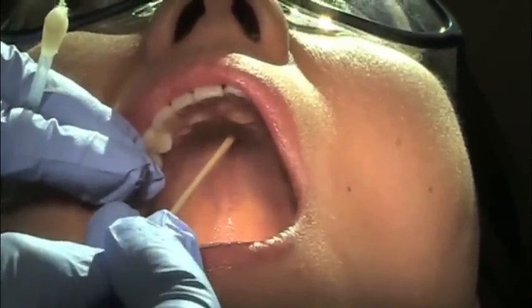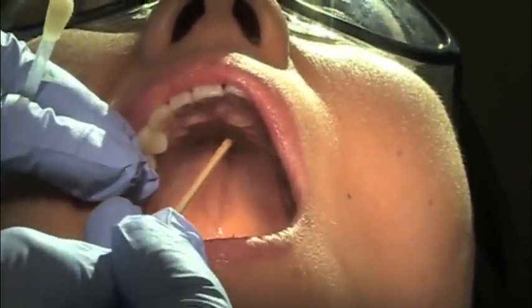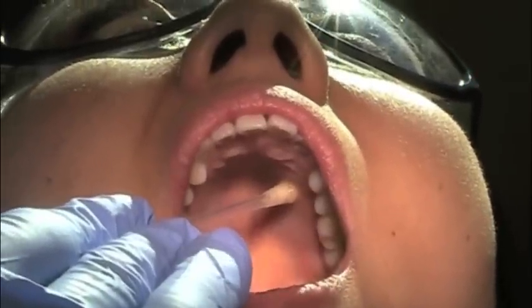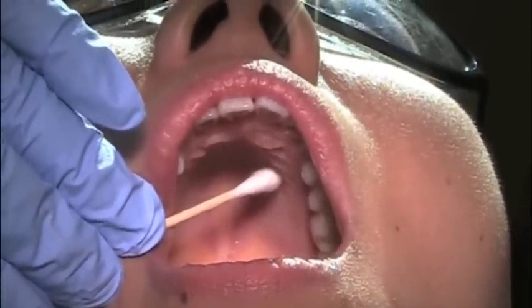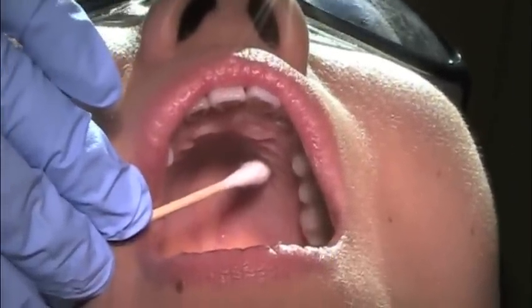Identify the mid-palatine suture and the two premolars. The insertion site is just the middle of these two structures. Apply topical. Apply pressure anesthesia using a cotton swab at the insertion site. It's about 30 seconds. You will see the tissue blanching.